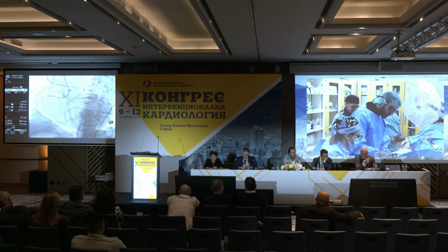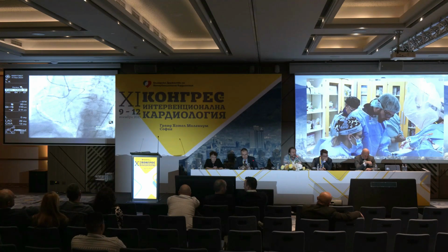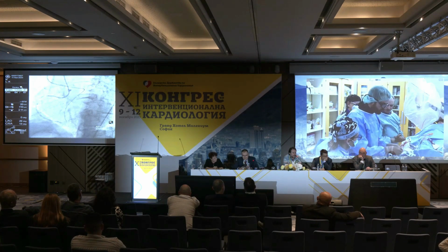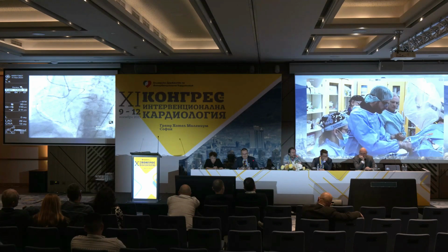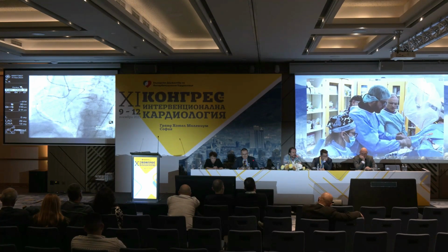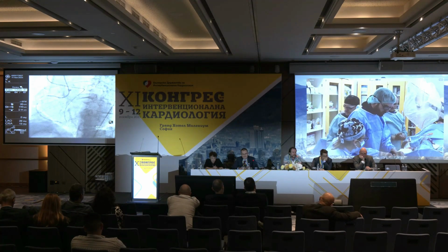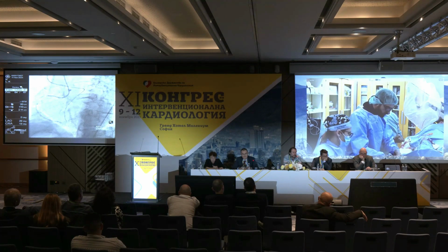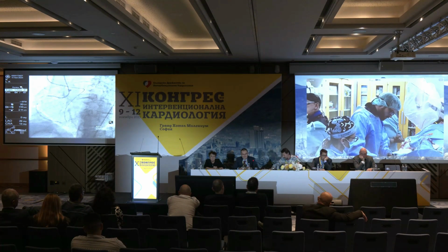Just about having a talk, George. When I meant going antegrade, I didn't mean going antegrade. I mean just preparing antegrade, just for the sake of the discussion. So I totally appreciate. I would maybe do the same, but at least you had the feeling there. Sometimes you have the feeling the conquest was outside the vessel, and it's not. I'm doing that also many times.